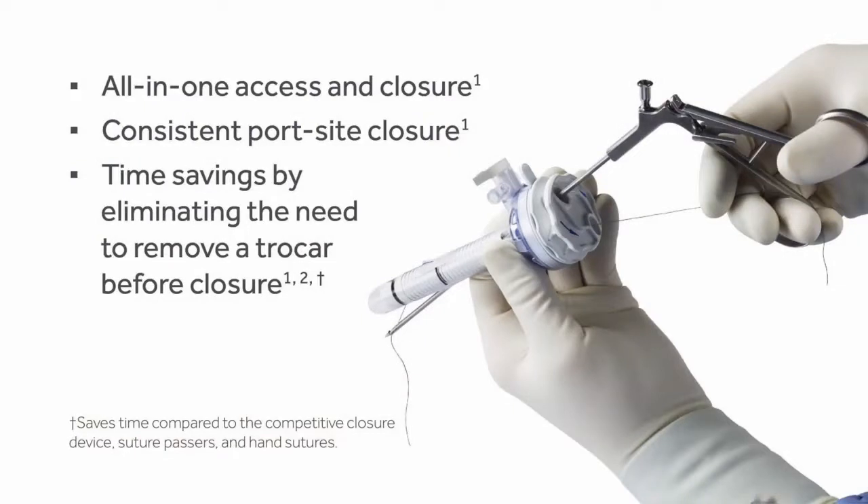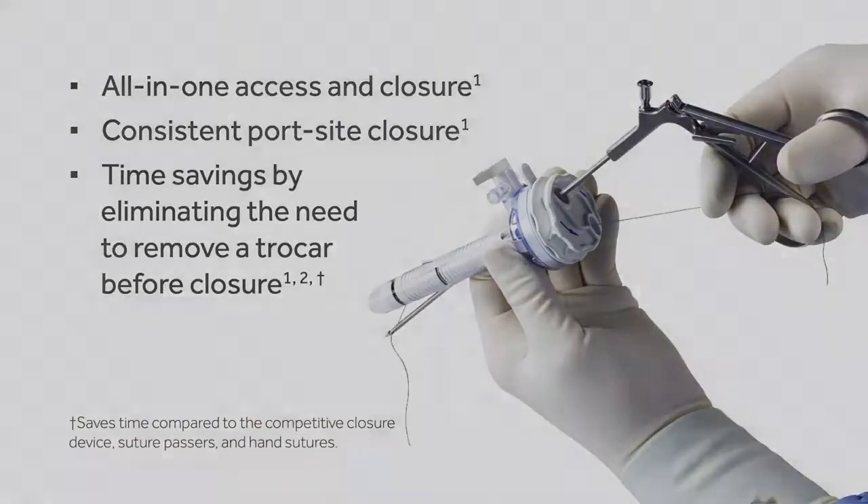It gives you all-in-one access and closure, consistent port site closure, and time savings by eliminating the need to remove a Trocar before closure. This video will demonstrate how to use the VersaOne Fascial Closure System.